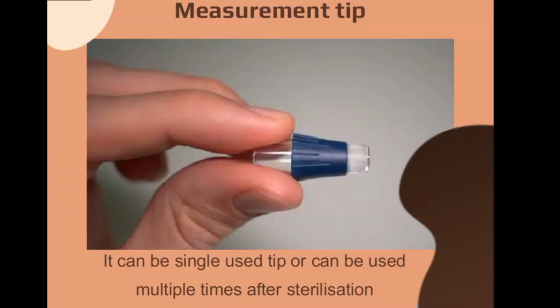So now we go back to our procedure, where we have said that we have anesthetized the patient, and we have added the fluorescein dye into the patient's eye. This was all about the principle on which the Goldmann tonometer acts, right? So now we are going to the procedure.